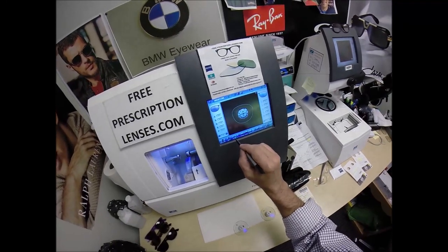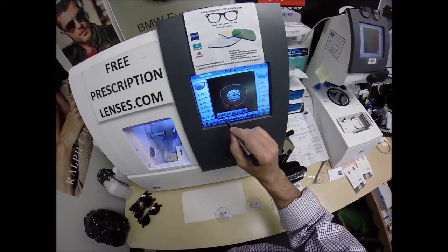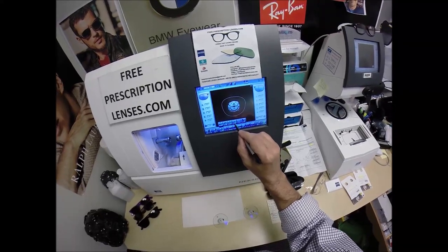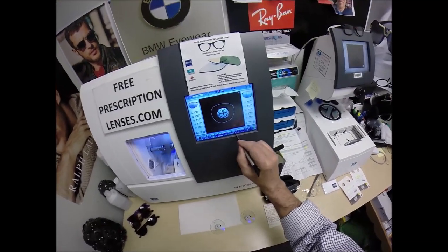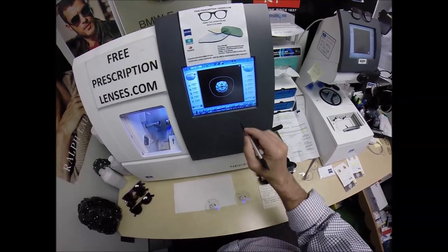So, these are polycarbonate lenses. If they were plastic, high index plastic, or Trivex, I would select that. But we're going to stick with polycarbonate because it's my material of choice. I'm not going to polish the edge of the lens because it's not going to be seen.